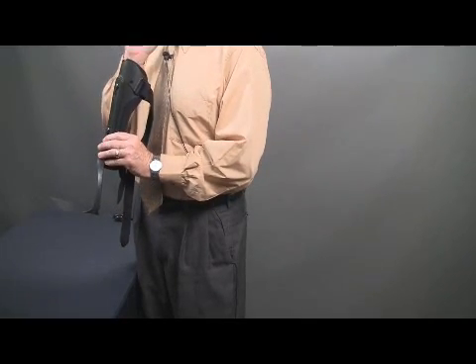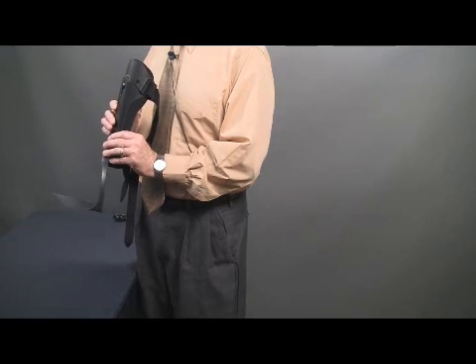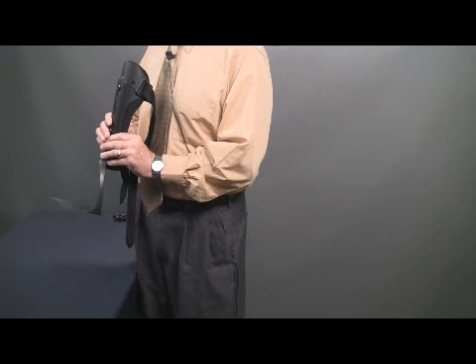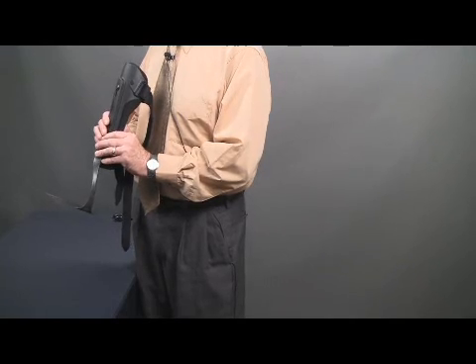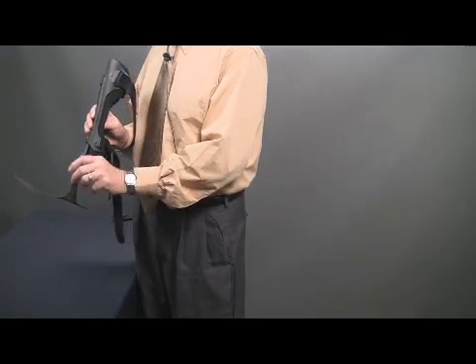But again, that's really not relevant to your fitting, because if you had that medium, you could really get it to function properly for you by where you place it in the shoe and what adapters you do to it. Say if you had a medium Matrix in stock and you needed it to work like a small, you would just get the clearance you need at the malleolus.